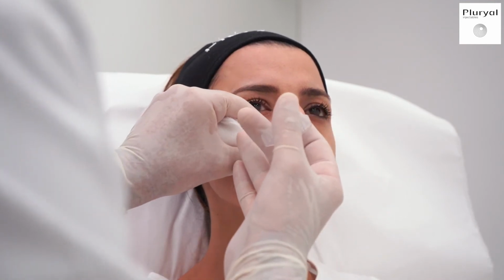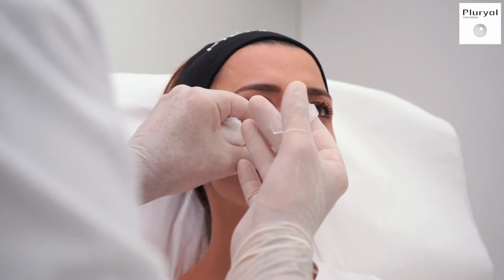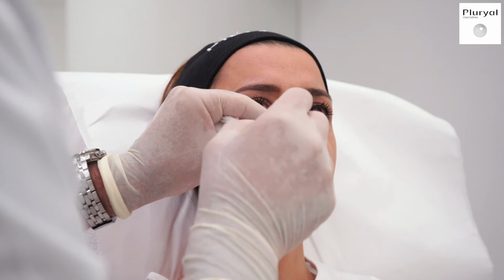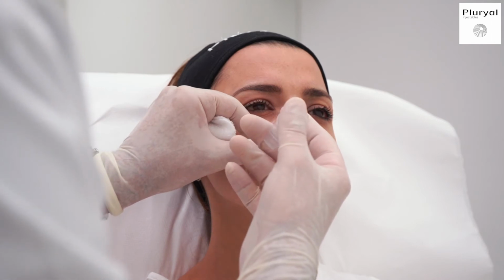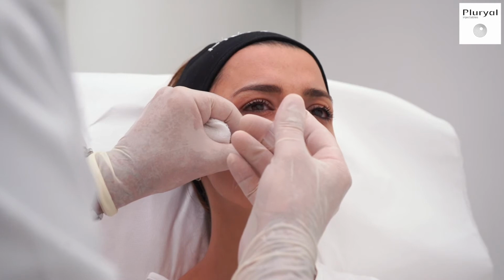So here also, it's a danger zone. You have to go all the way to the bone. You should aspirate here. And inject 0.25.